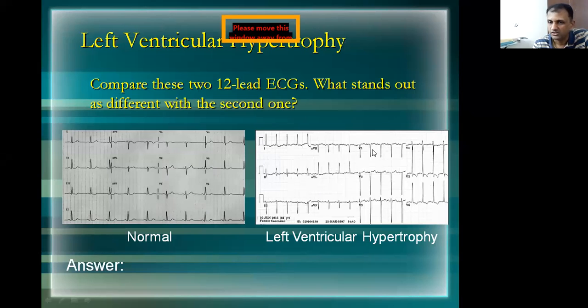But if you look at this ECG, it's more negative. Anything below the isoelectric line is a negative deflection, and it gets only worse. It's just more negative. That's abnormal. The reason is the heart muscle is very thick, and if you remember, we discussed axis, the QRS axis, last week. It has something to do with this pattern in the ECG. Because of the muscle thickness, the morphology of the ECG is different from the normal ECG.